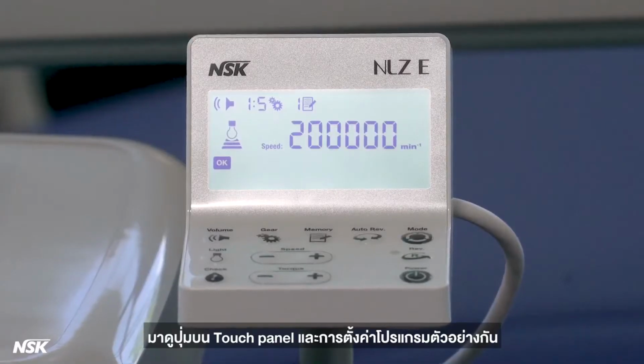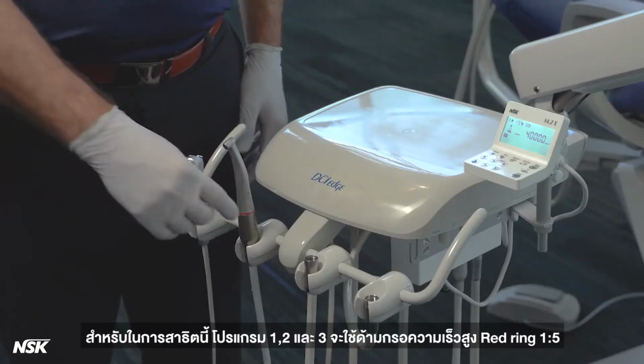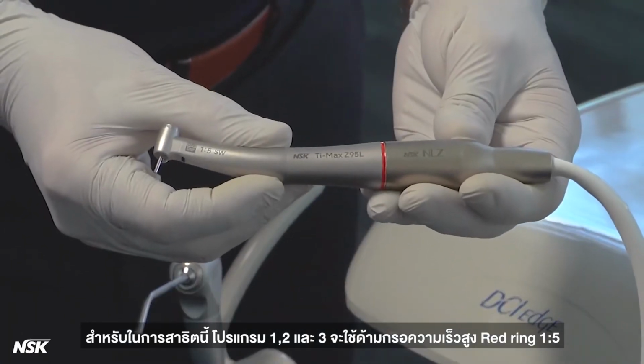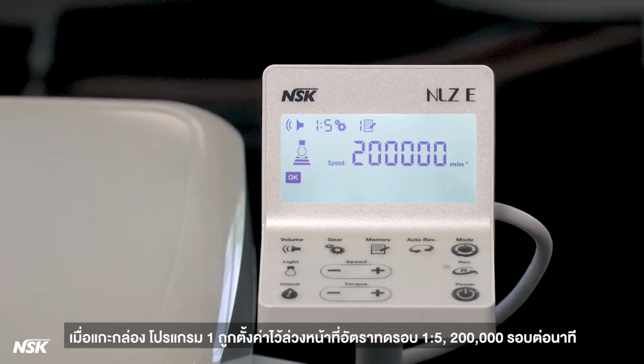Operation. Let's review the buttons on the touch panel and set up a few sample programs. For this demonstration, programs 1, 2, and 3 will use a high-speed attachment, red ring 1 to 5. Out of the box, program number 1 is preset at 1 to 5 gear ratio, 200,000 RPM.